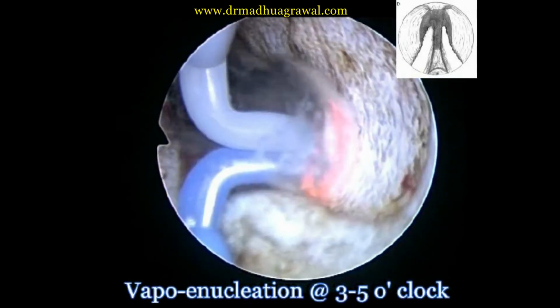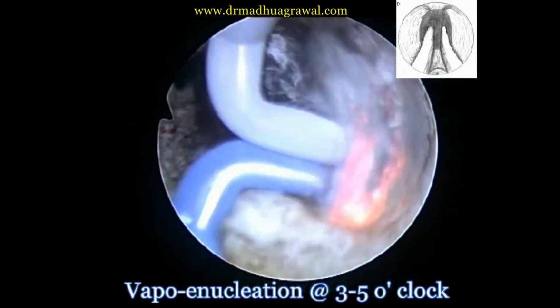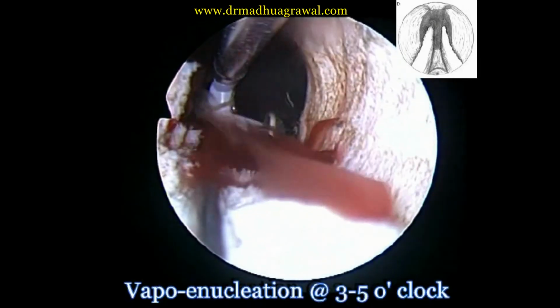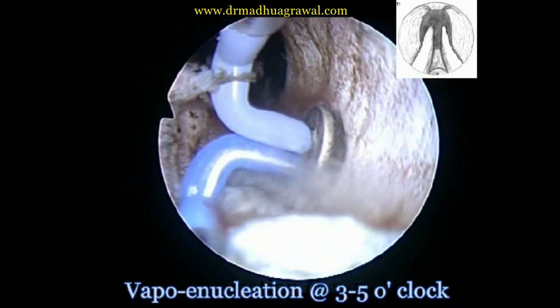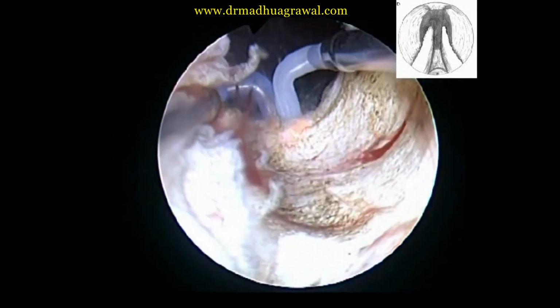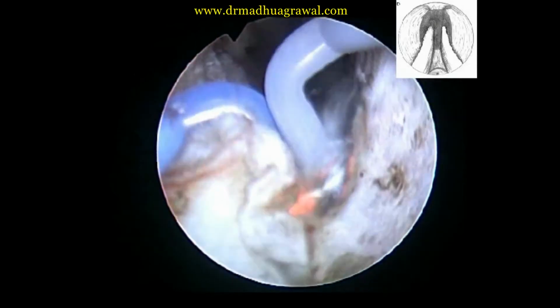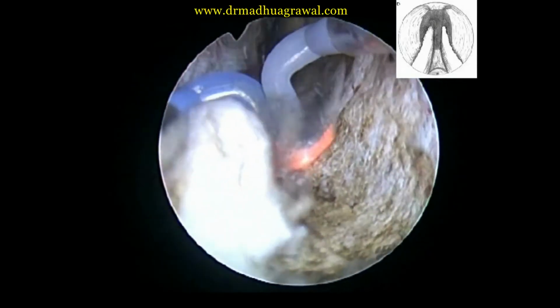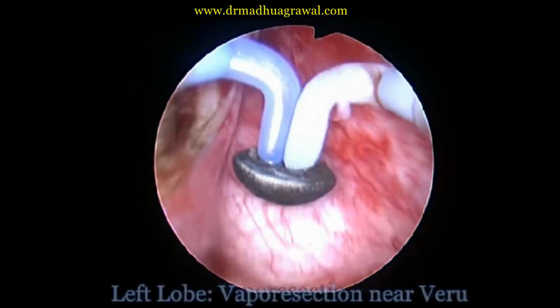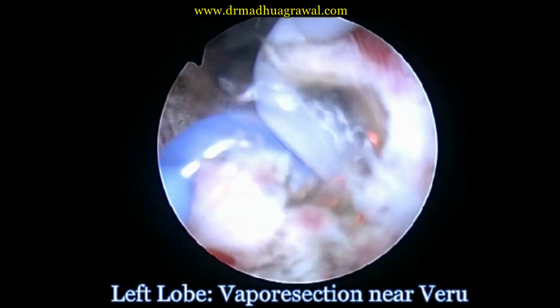While working on the left lobe, the trough is developed between the capsule and left lobe, sweeping down from 1 o'clock down to 3 o'clock, further down to 5 o'clock position. Enucleation of the lobe along the distal part, near veru, can be a bit tricky.